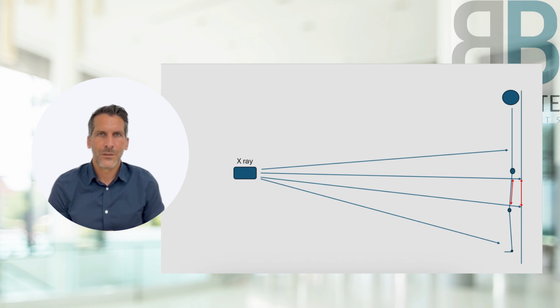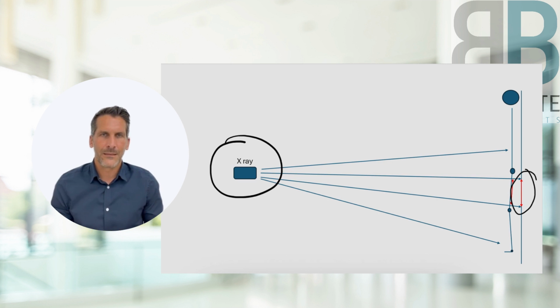In X-rays, we have a radiation source and a receiver plate behind the patient. Now you have to know that the X-rays are never arranged parallel, but always diverge slightly. That is, they fan out a little bit in the beam path. Attempts are made to counteract this by placing a grid behind the X-ray source. This is intended to prevent scattered radiation. Nevertheless, a residual divergence of the X-rays remains and always leads to a magnification effect of the object being imaged.